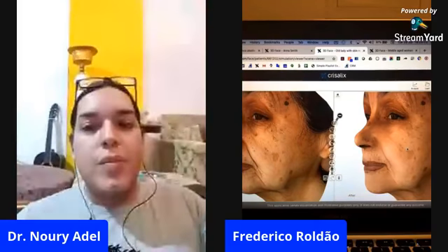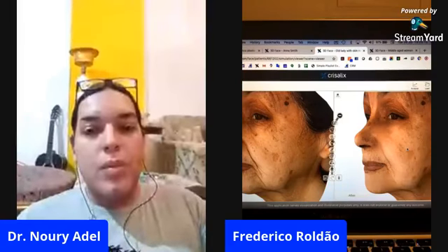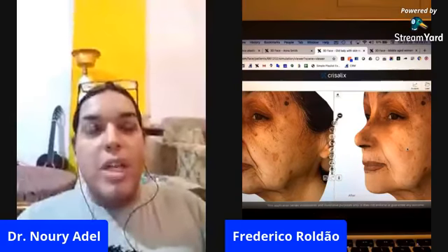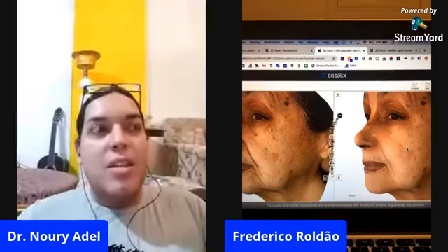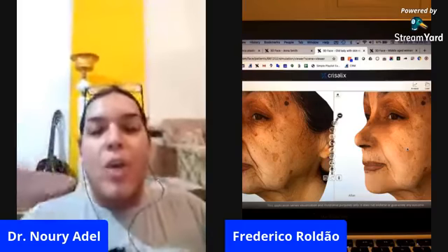Yeah, we believe that Crisalix can be a differentiator. So, I mean, if I am a patient and I have that doubt that you mentioned in the beginning, how may I look after my treatment? I will certainly want to see something. That's why, if someone can offer this and someone else cannot, I will choose that person. Yes, I was very excited about the webinar because this was how I was thinking about it.